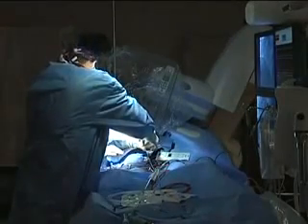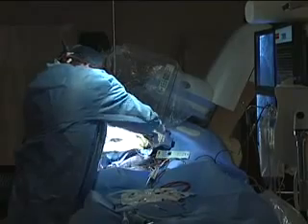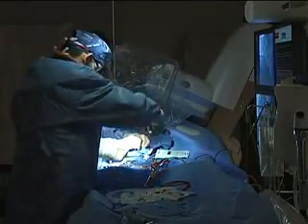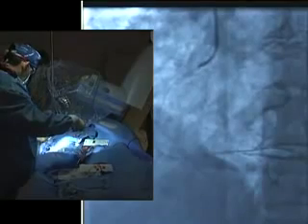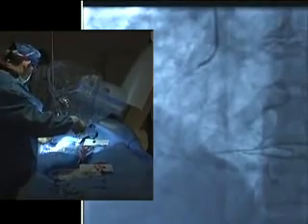So now with the balloon, we opened up the critical blockage, but we still see a lot of thrombus in the vessel past the blockage. So we're going to put what's called the export catheter back down and withdraw a little bit more clot from there.